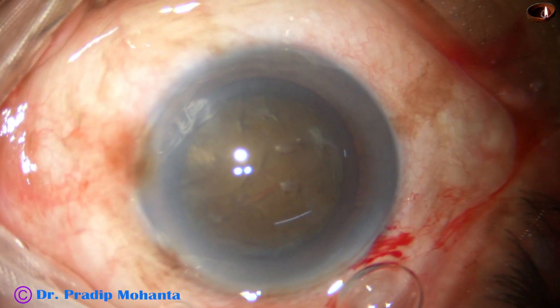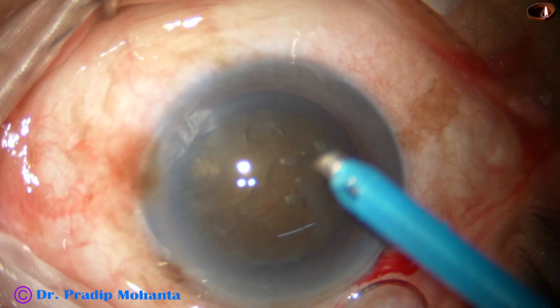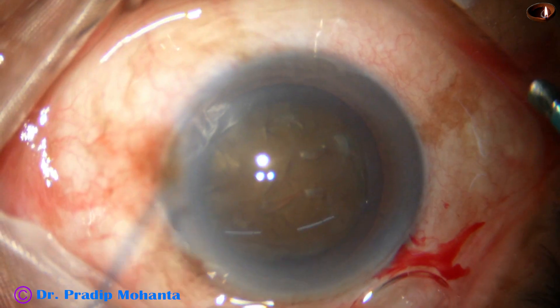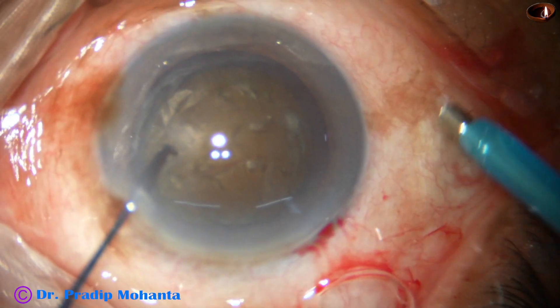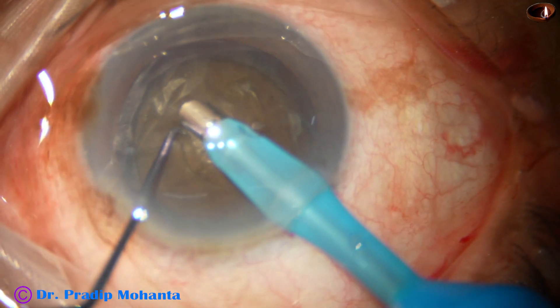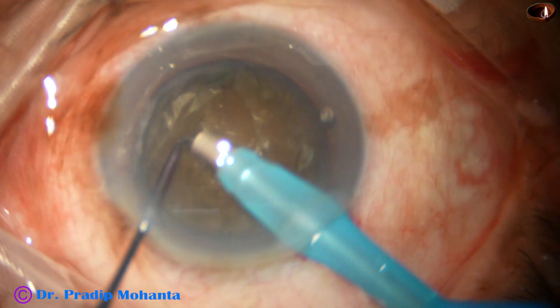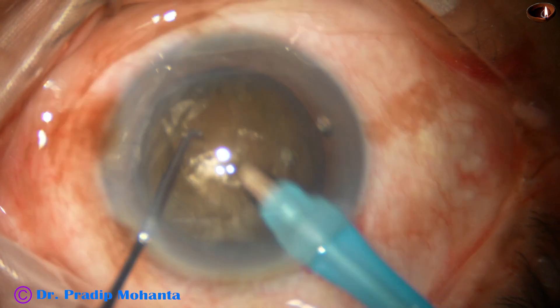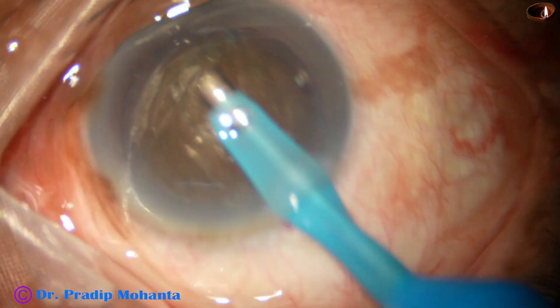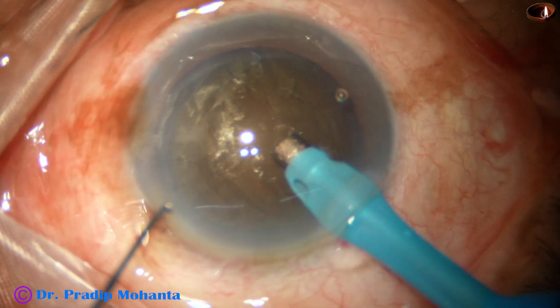Hydrodissection is done and the anterior chamber is filled with viscoelastic. Now the tip of the needle is exposed a bit more in such cases to deliver more ultrasonic energy. In such cases, I usually do my submarine chop technique, and if that fails, then I make a deep crater at the center and do a crater and chop technique.